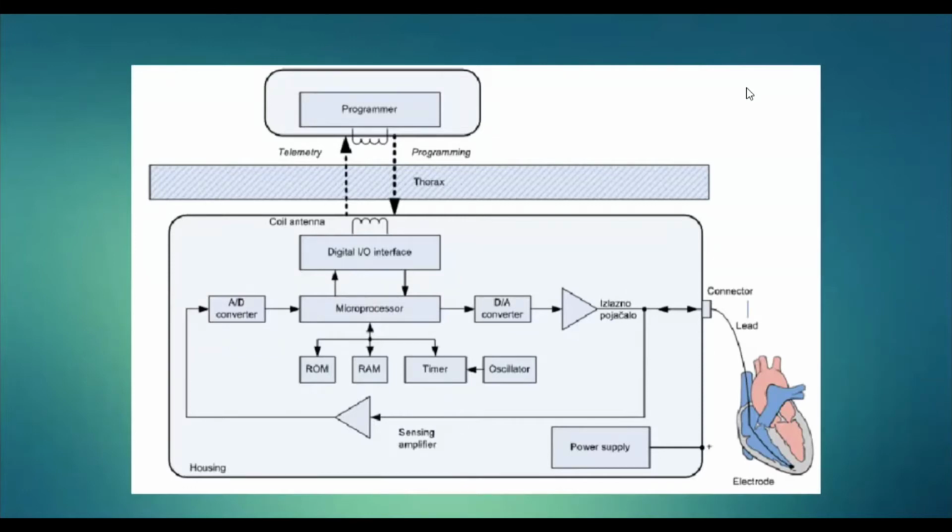The processed signal is compared with a reference voltage to determine if the signal exceeds a threshold detection level or not.